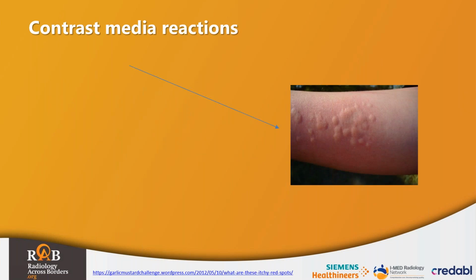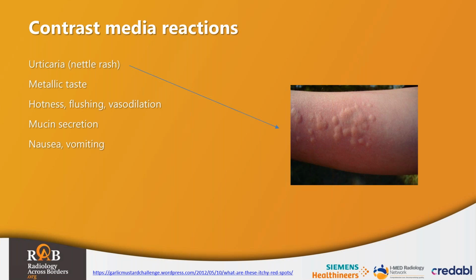As contrast media is a form of medication, and obviously a foreign entity to the body, there's always a potential for a reaction, just like any other medication. There's a range of potential reactions that people can experience, from welts, rashes, hot sensations, to the metallic taste we all talk about, to more serious reactions at the bottom of this list. So we're briefly going to talk about contrast reactions.